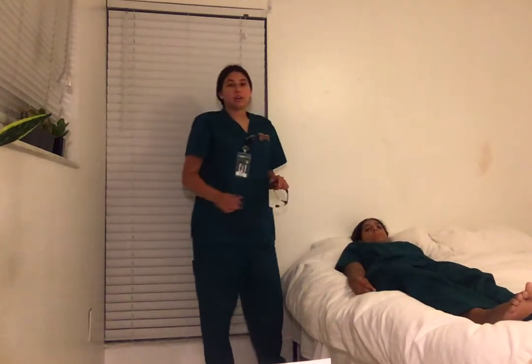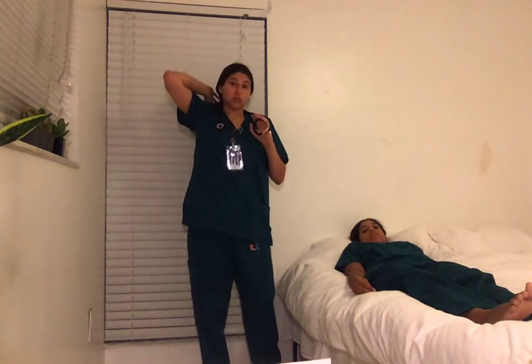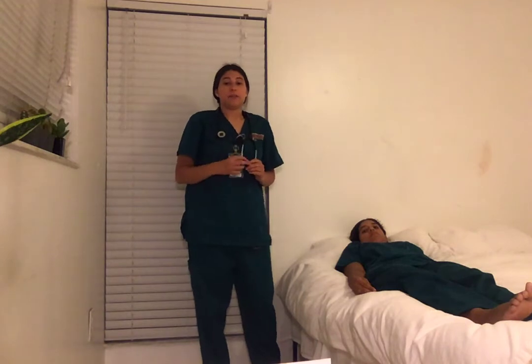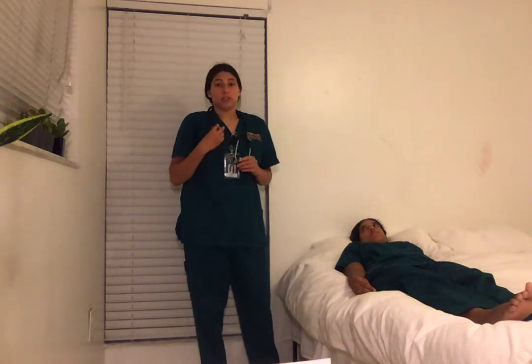Any additional heart sounds I may hear, I could hear an S3 or an S4, which would be pathological or physiological, and I would have to investigate further. I would use the bell of my stethoscope in order to listen to those and murmurs.